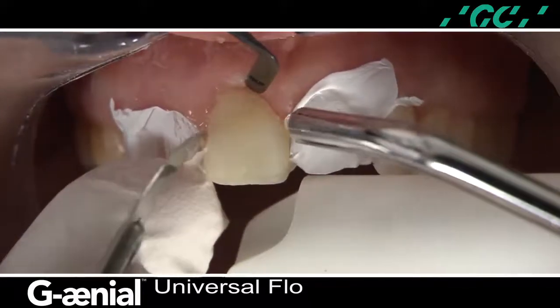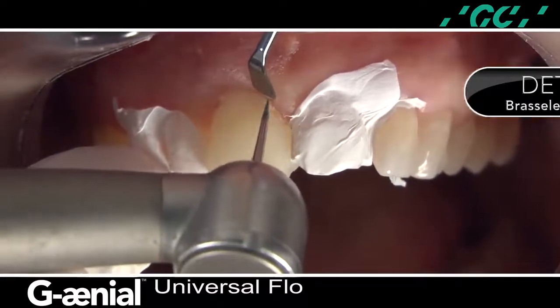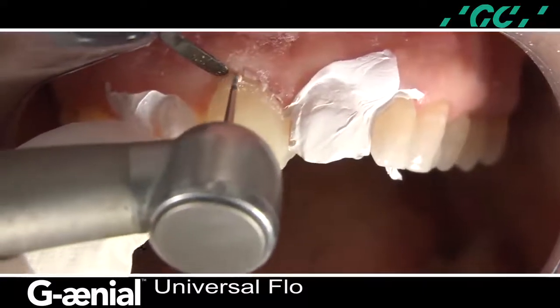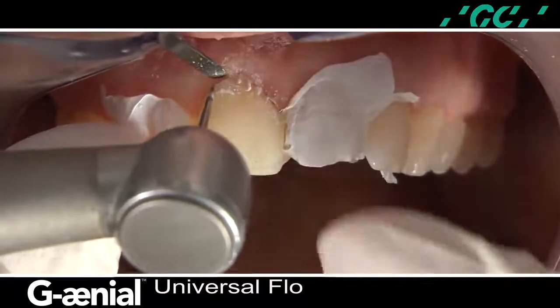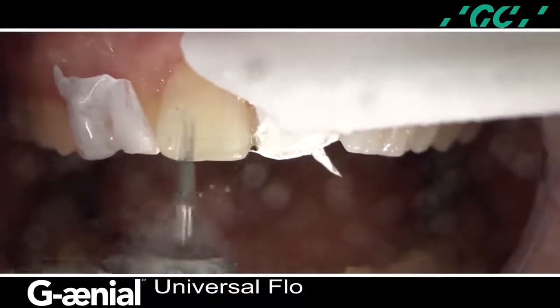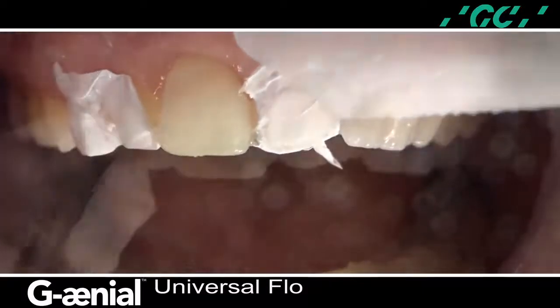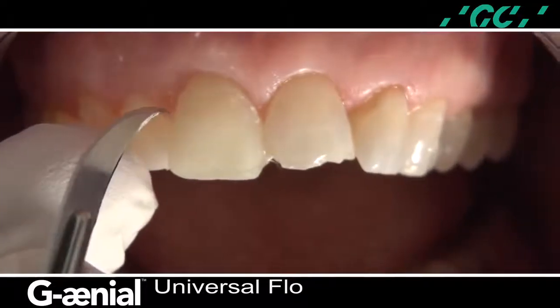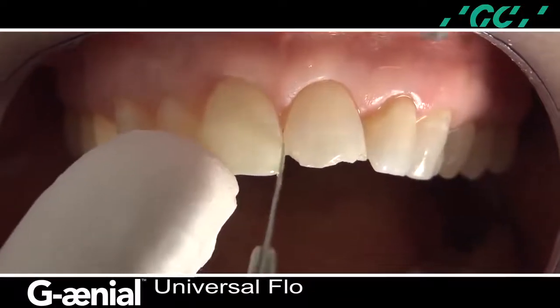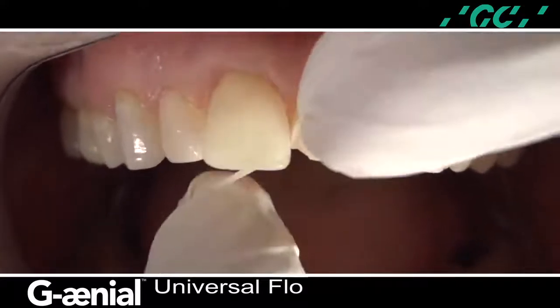The gingival areas are contoured and finished with a 30-micron tapered finishing diamond, a DET3 by Brassler, retracting the gingival tissue with an 8A instrument by Euphredi. It is important to inspect not only the emergence profile but the interface for marginal integrity during gingival retraction. The natural anatomic facial contour of the central incisor is maintained using an 8-fluted needle-shaped finishing bur, an ET9 by Brassler. The gingival interface is inspected and any residual resin tags are removed. The proximal surfaces were inspected for adequate contact and any residual resin tags or overhangs using unwaxed floss.